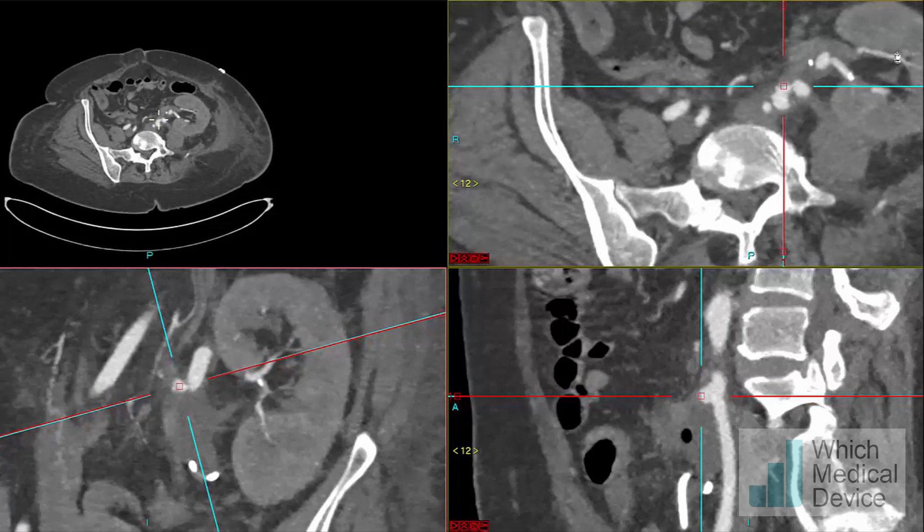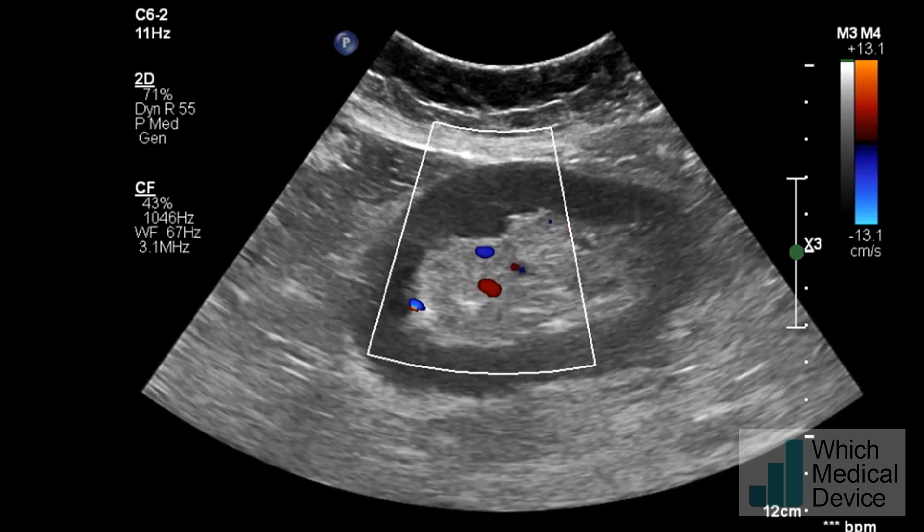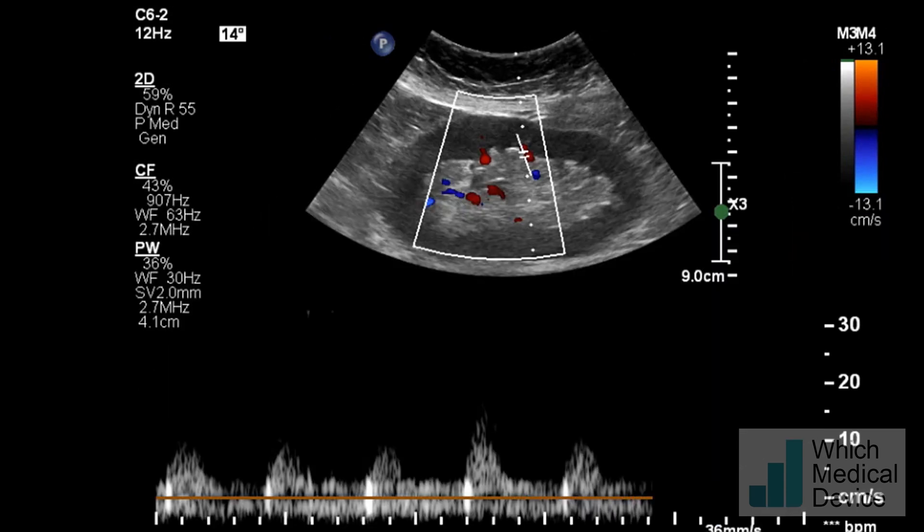More peripherally, the kidney still seems relatively well perfused. The Doppler flow looks quite good, but when you look at the waveform, there's a very slow upstroke indicating a significant proximal stenosis.